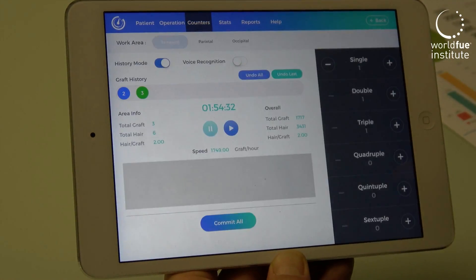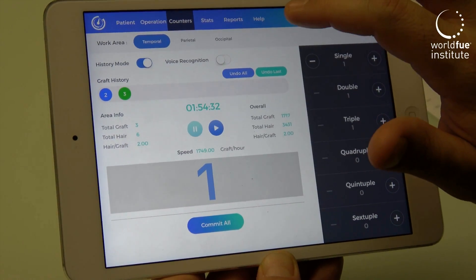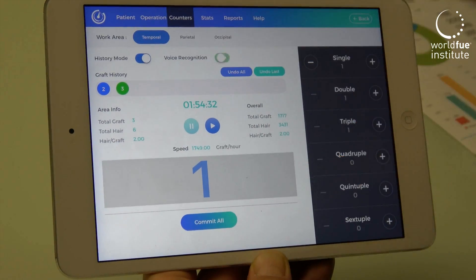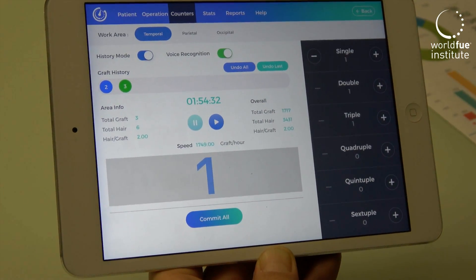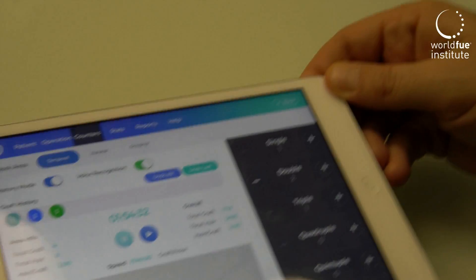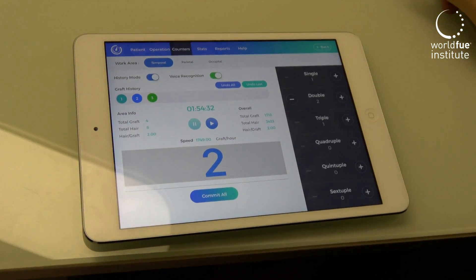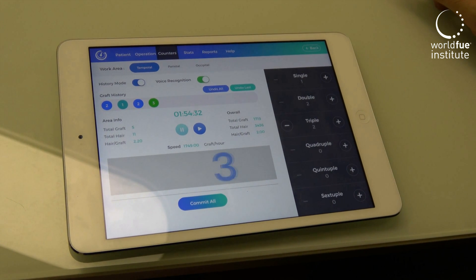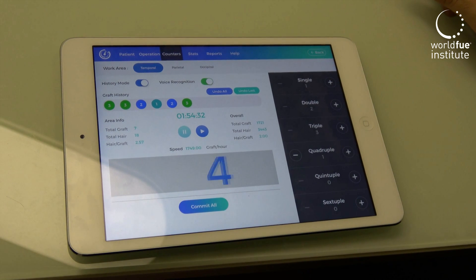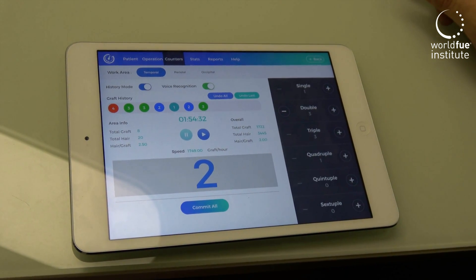At the same time, it has voice command. If you have an internet connection, it uses Siri. You can activate your voice command and you don't have to touch it — you can leave the application running. When you count, for example, 3, 4, 2, the application counts itself automatically.